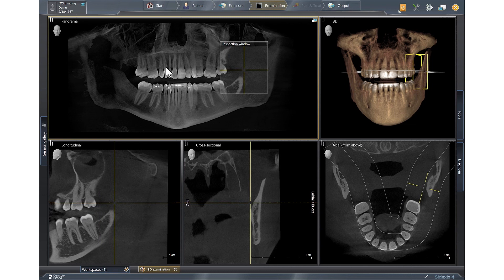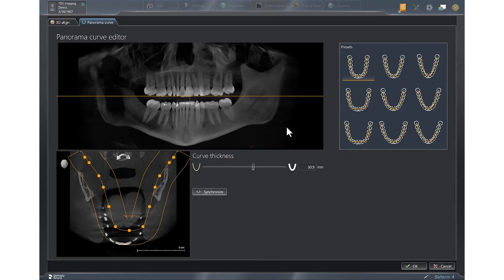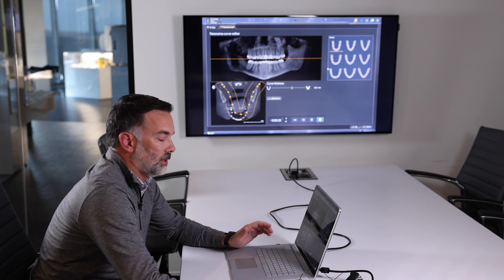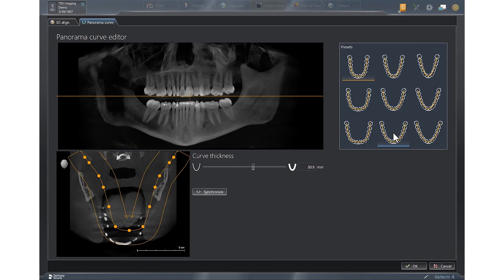In order to optimize this, we are first going to right-click in the panorama window, go down and select Adjust 3D. It's four simple steps to complete optimization. First, always select the arch on the bottom row in the center.